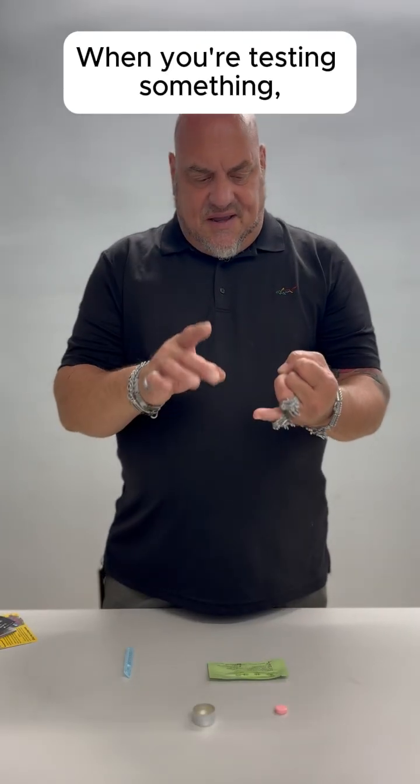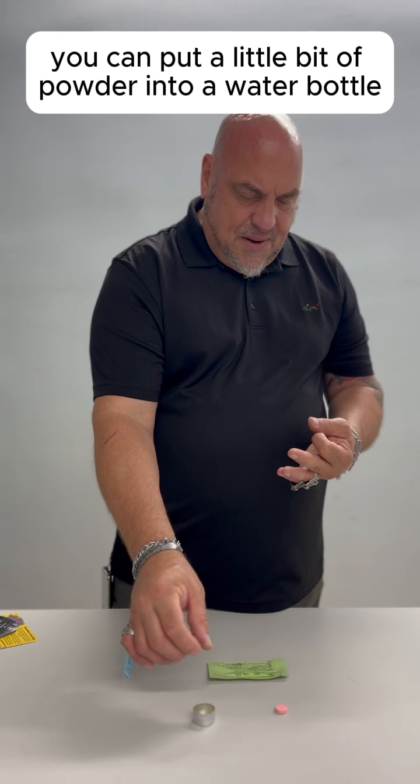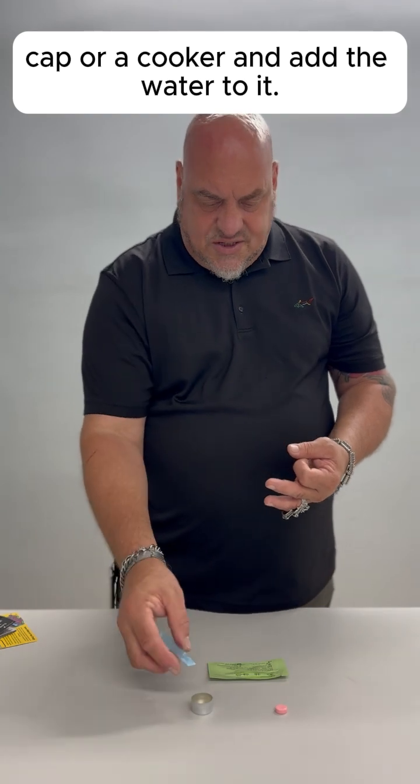When you're testing something, if it's powder — whether it's cocaine, crack cocaine, or methamphetamine — you can put a little bit of powder into a water bottle cap or a cooker and add the water to it.